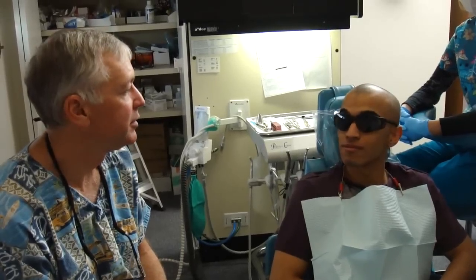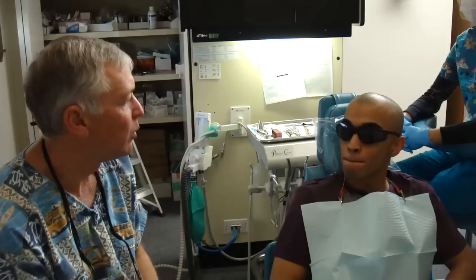How are you doing today, Mo? I'm doing good, thanks. Good. So we're going to do veneers for you. Now, what was it specifically that you would like changed about your front teeth?